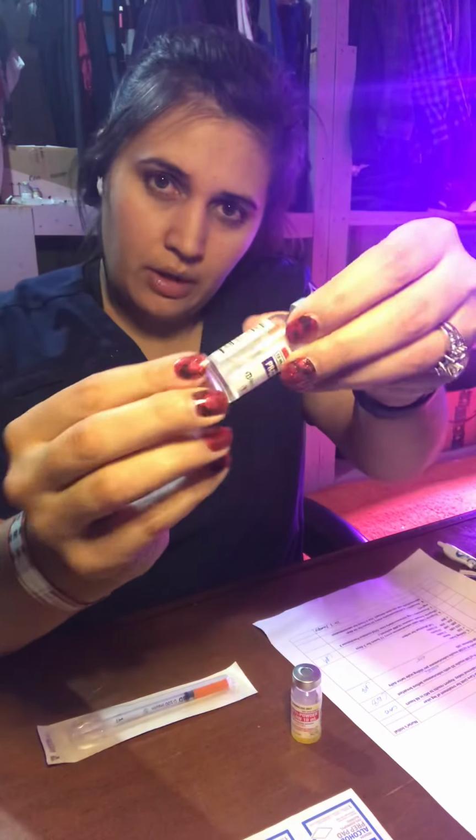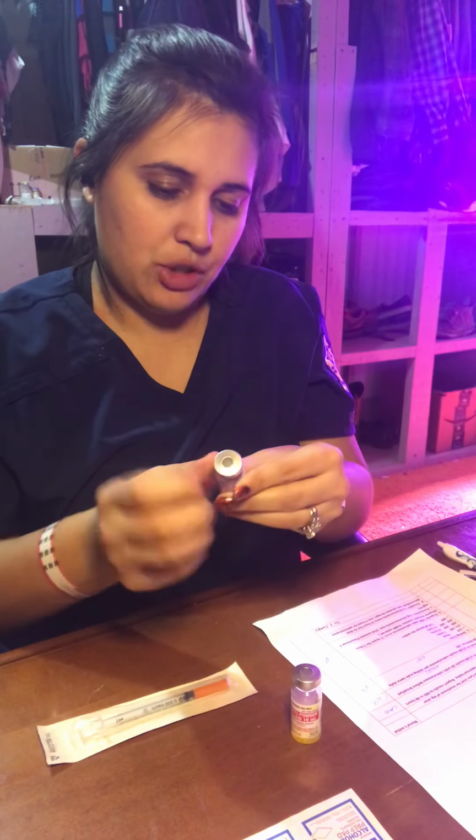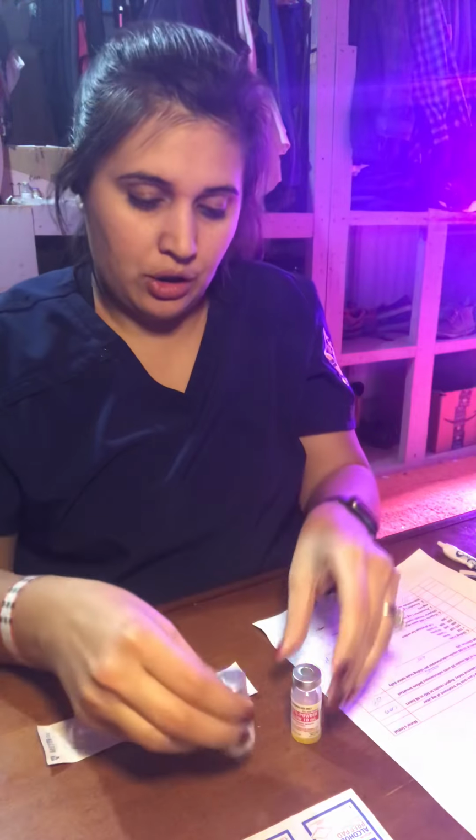Again, this is the Humulin R, the clear. Again, I will check the vial. I will check the expiration date. I will check when it was opened, because it's only good 30 days after.